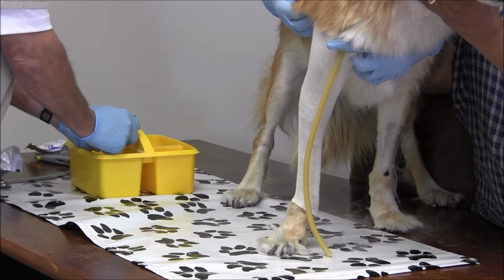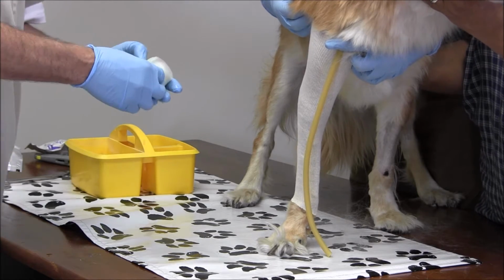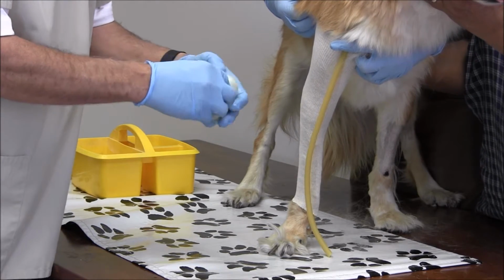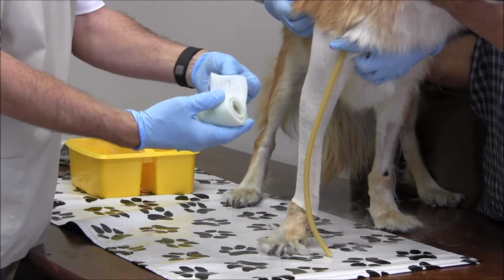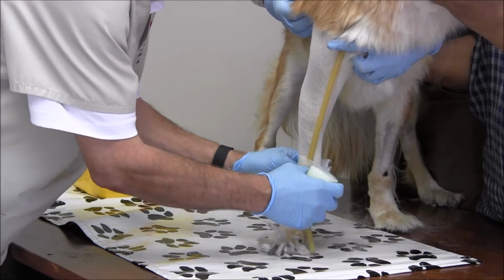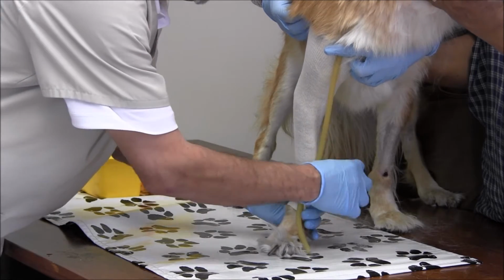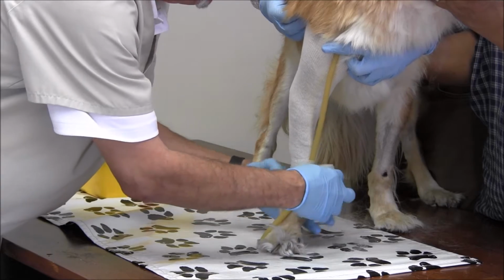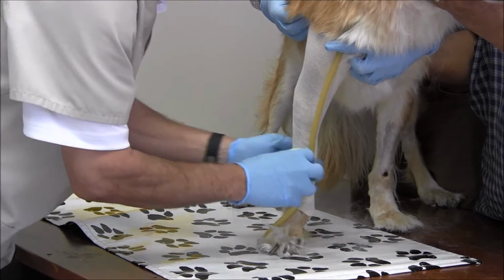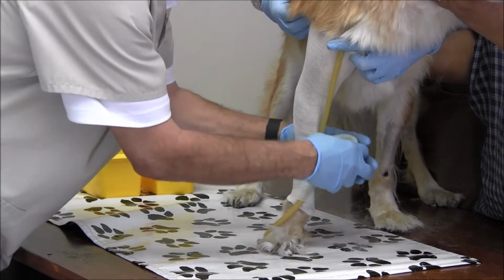So the water's been in there, and we just use regular tepid water. We squeezed it 3 times. We're going to start, and we're going to roll away from us. We're going to have the tube on the front. We're going to start all the way down at the carpus. And we're going to wrap, keeping the tube in front.